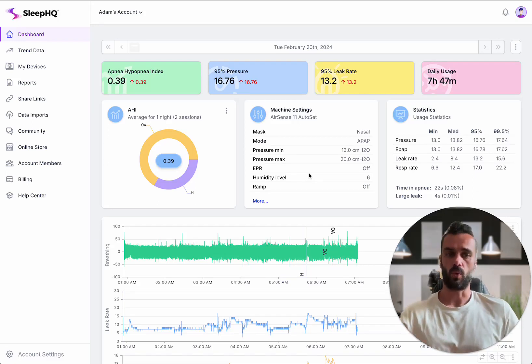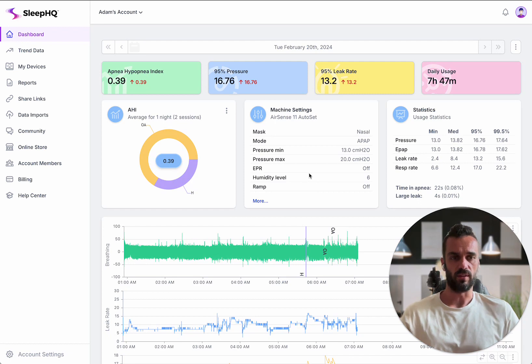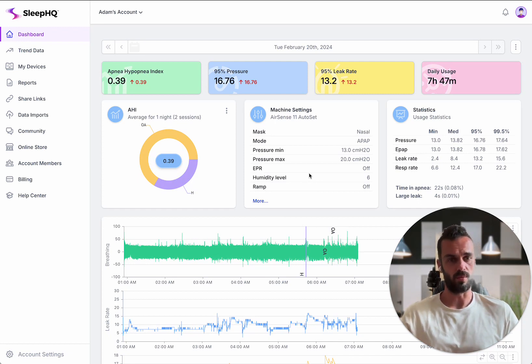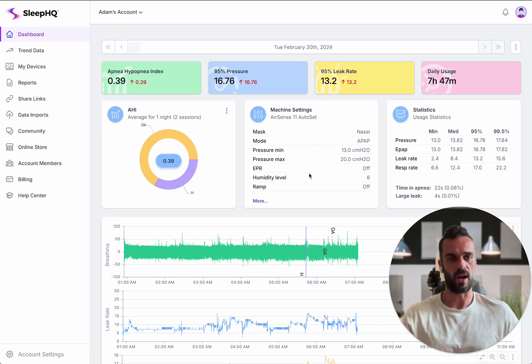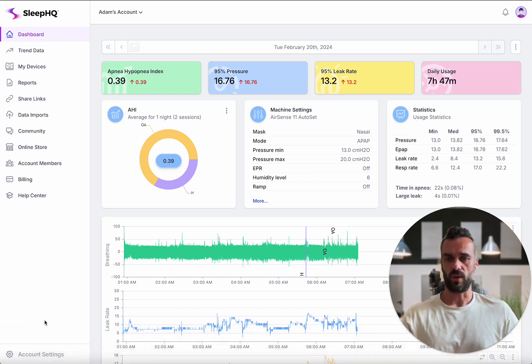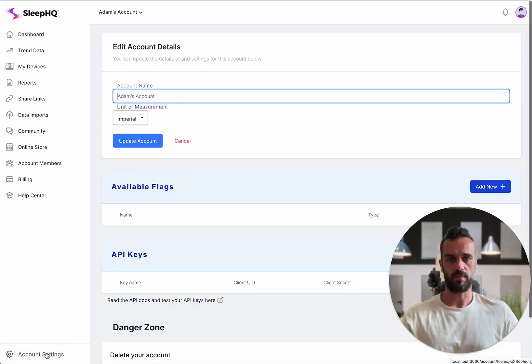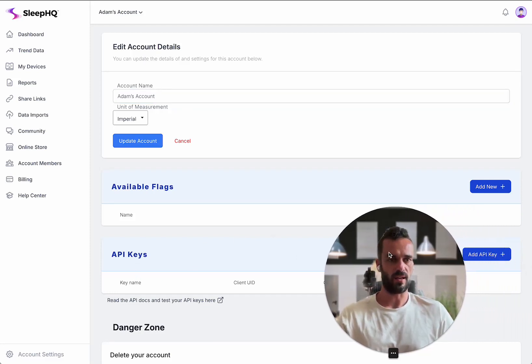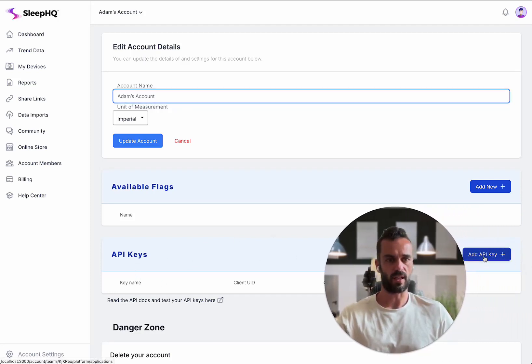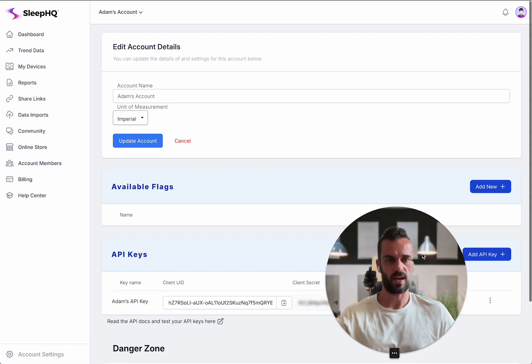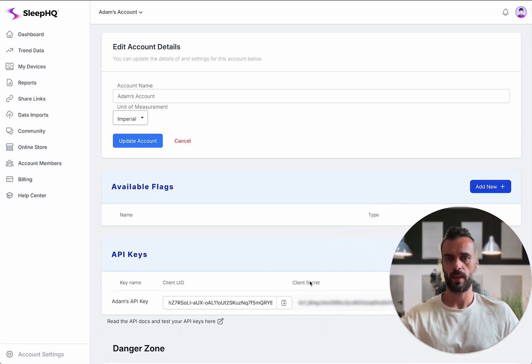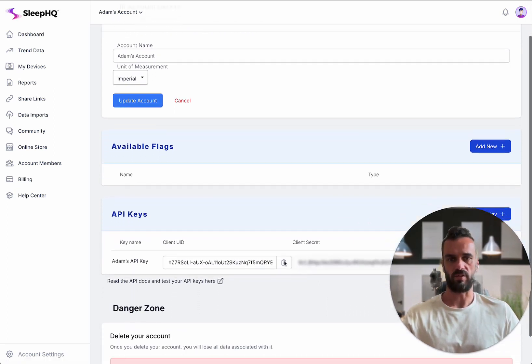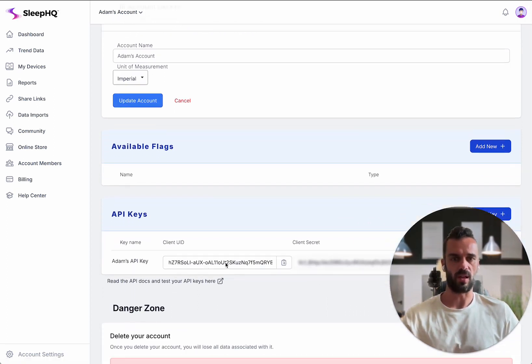So what I thought I would do today was just give you a little demo of what's coming and some of the things that you're going to be able to do with the SleepHQ API. When I click on account settings down the bottom here, we've got this new API keys section and I can click add API key like that and now it's giving me this new API key.